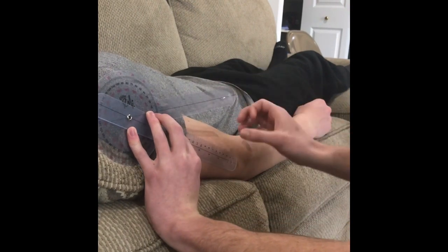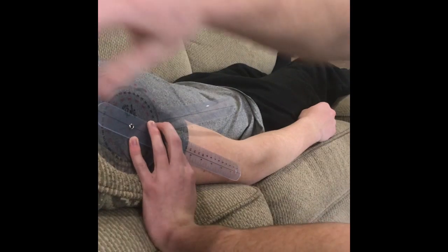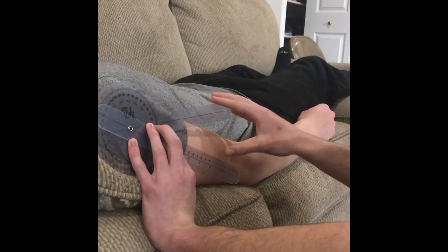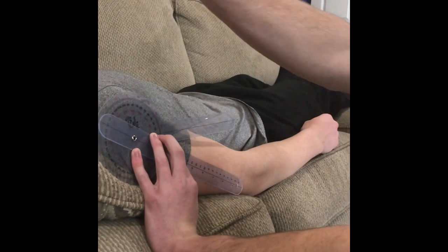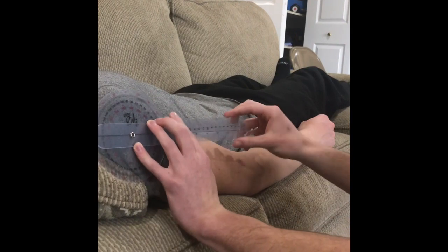So when the time comes, you're going to have your patient raise their arm as high as they can up towards their head, up until they start to recruit the muscles in their back to use them. Once they start recruiting muscles, you need to move them back to a previous position to see the full extent of their shoulder flexion.